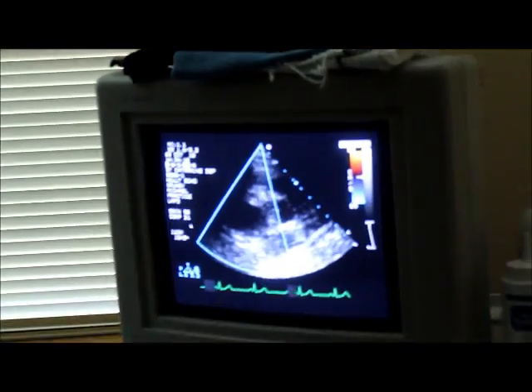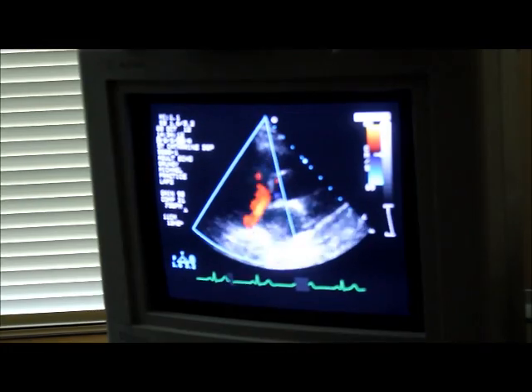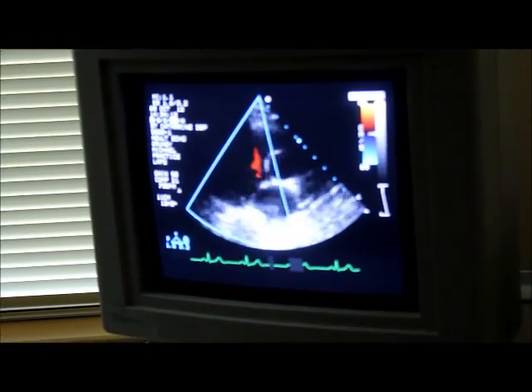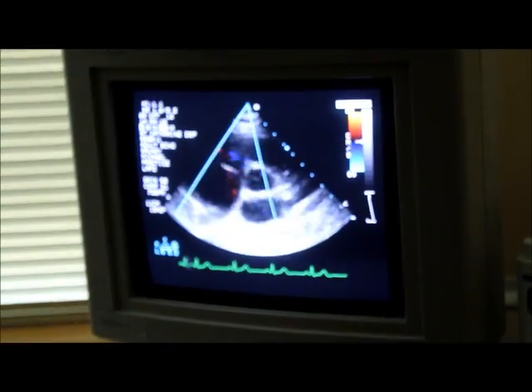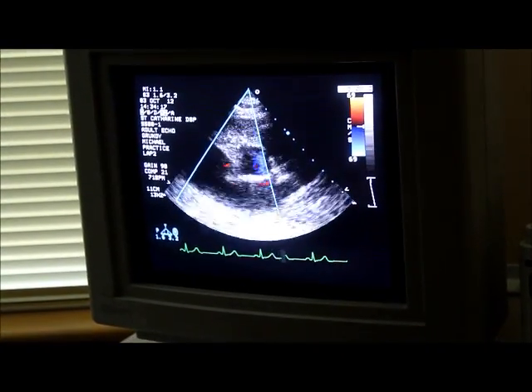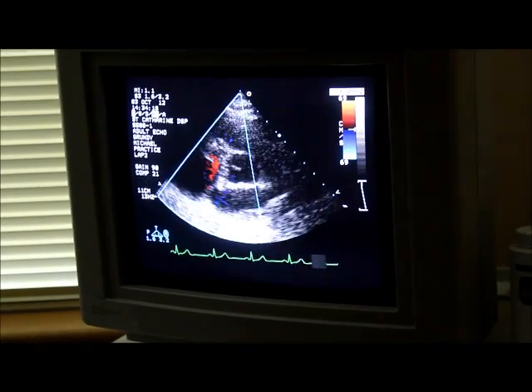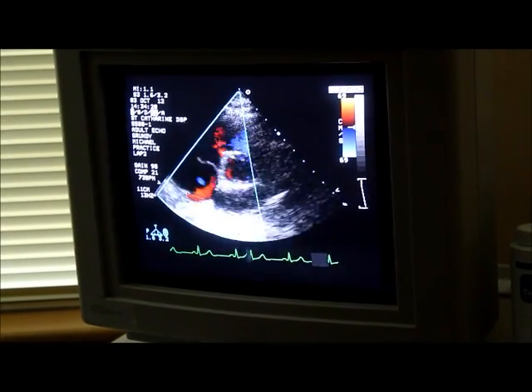Don't struggle — we want to be right at the path, and we're going to rotate and see how we make it oblong, kind of oval-ish.